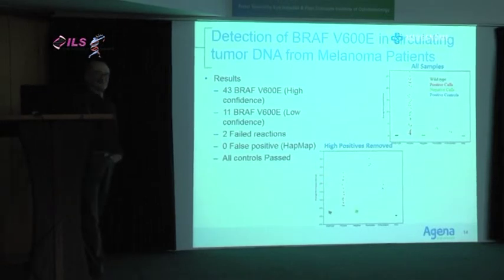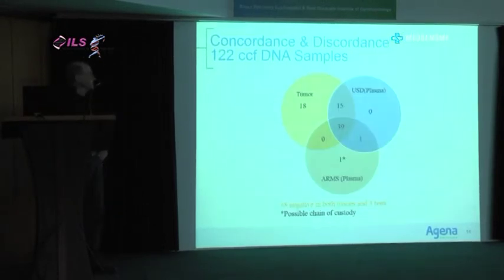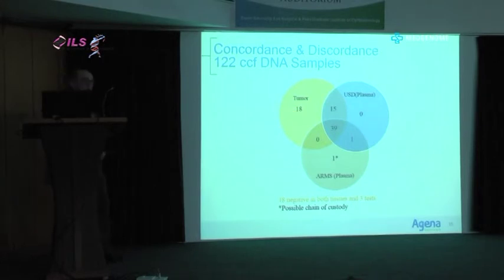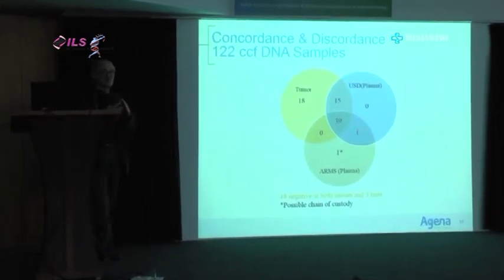What's of interest, and somewhat confusing at first, is to compare liquid biopsy with solid biopsy, and we have that for these patients. Forget this PCR result. Let's just look at the solid biopsy in yellow and the liquid biopsy in blue. In this case, there's about 75% concordance. But in the liquid biopsy, we miss about a quarter of the patients, and we see one patient that's not present in the tumor. But in other studies, it's the other way around. You can have a lot of false negatives, and a lot of things that, if you didn't know better, you would call false positives. So just remember what's going on here.